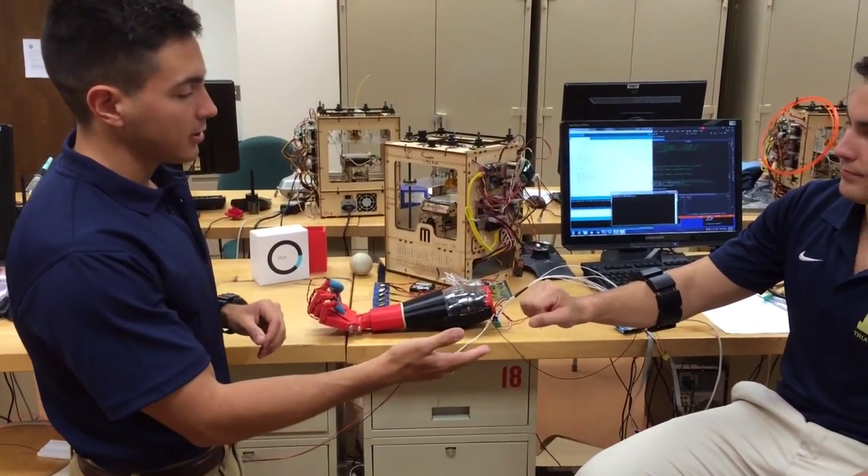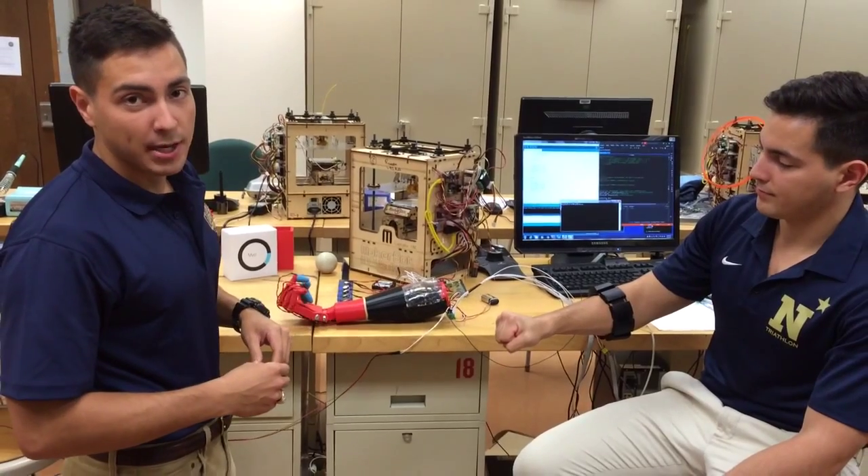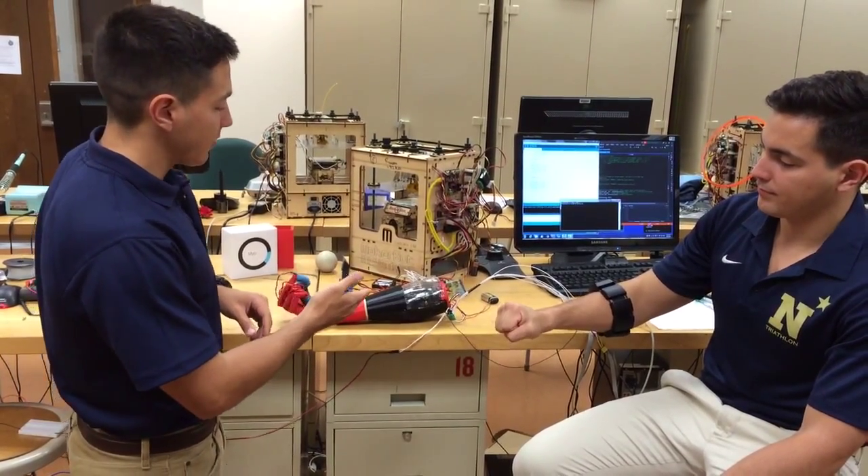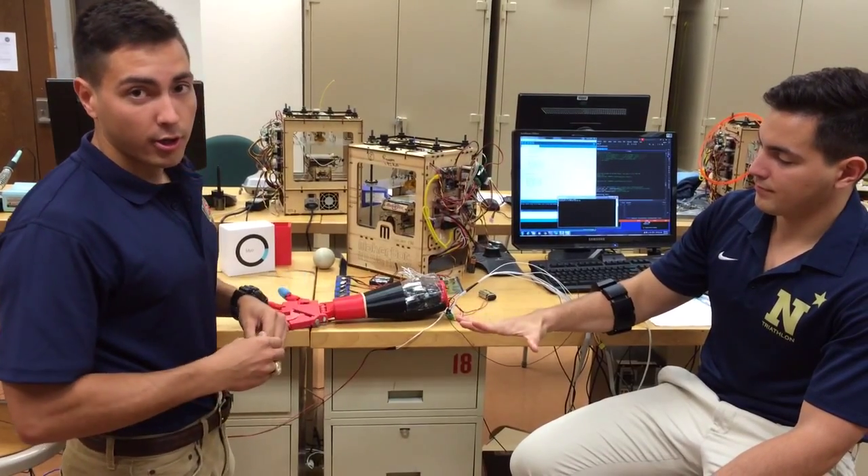As you can see, the myoelectric signals from John's hand are being picked up from the myoelectric armband and being sent to the five servos to control our prosthetic.